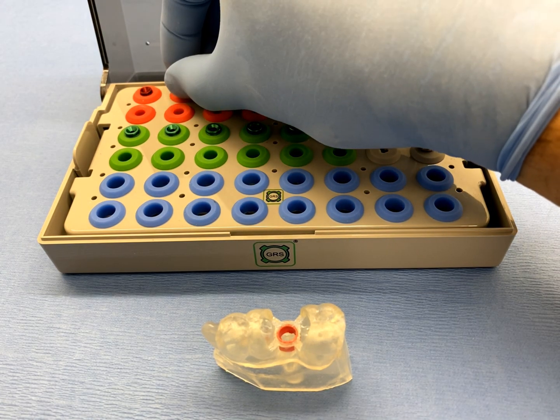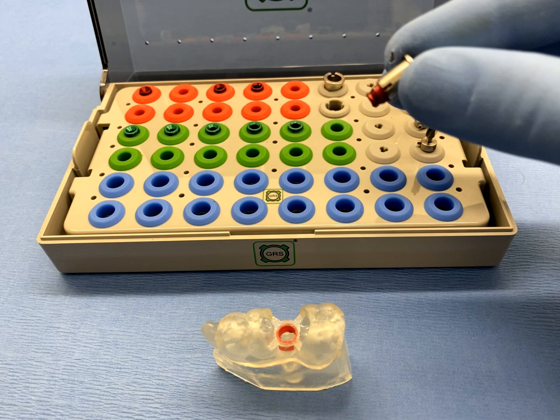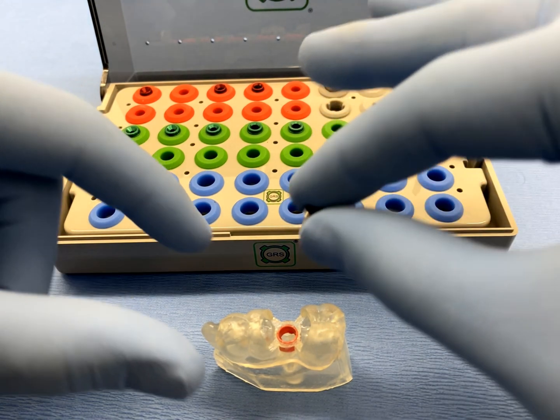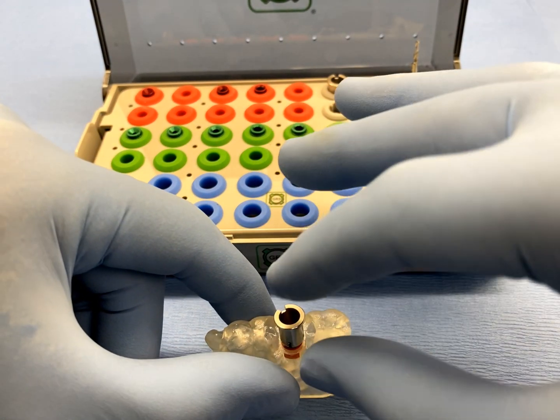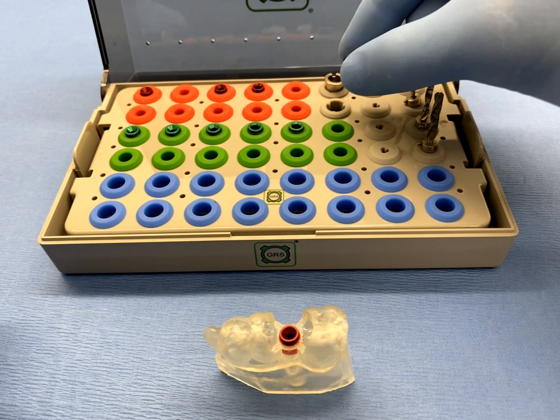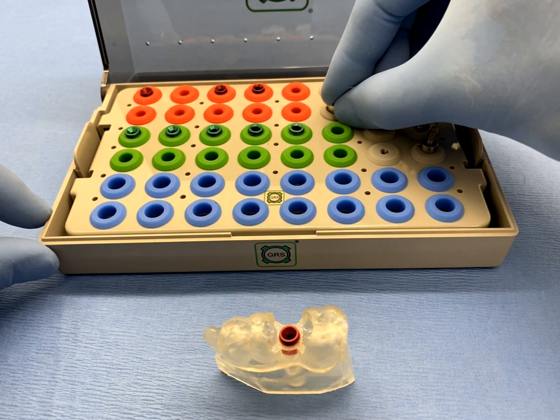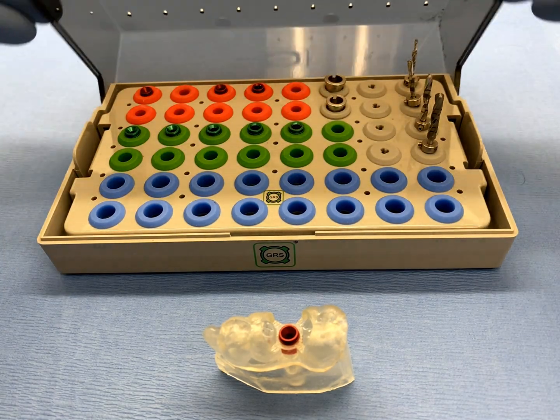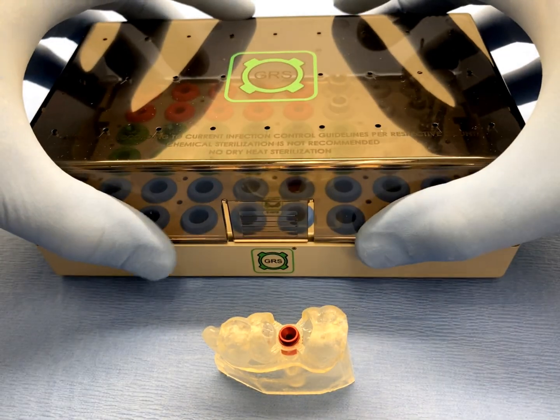If the drill shank cannot pass through the narrow diameter surgical sleeve for the pilot drill, use a 2.35 mm or slightly larger GRS drill sleeve in order to allow the initial drill to insert completely to the bottom of the osteotomy in the 3D printed model.